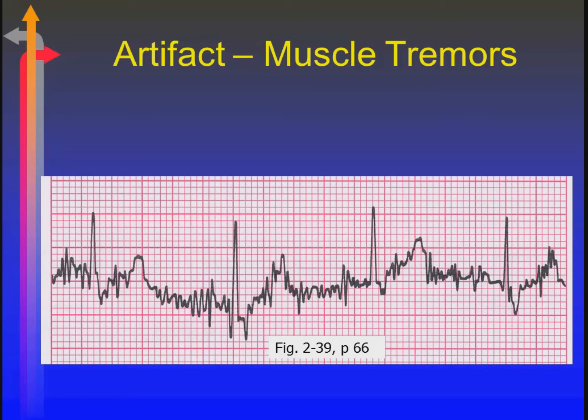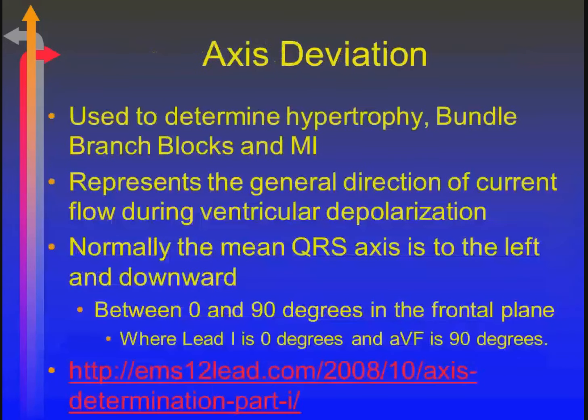If you're ever in the CCU and you really want to have fun, go like this with your electrode and watch the nurse go crazy, or tap it. Nasty.